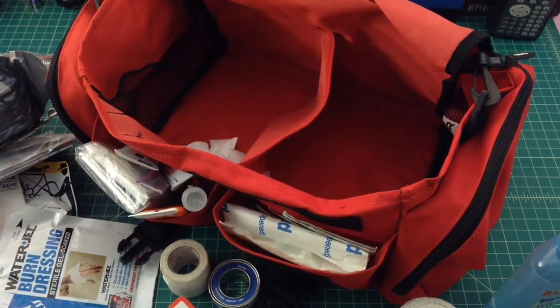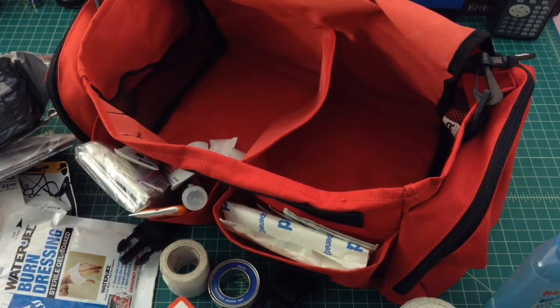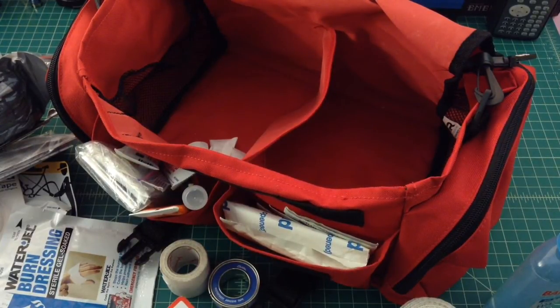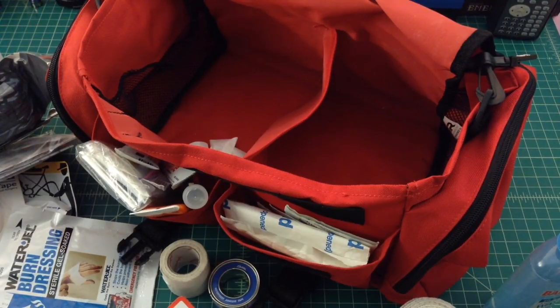That's the car first aid kit — I think it's pretty good. There are some things I could obviously add, like ibuprofen, Imodium, and Benadryl. There are also questions around whether there should be more trauma-type supplies in here. Anyway, if you've got any thoughts, comments, or recommendations, they're appreciated. Thanks everybody.